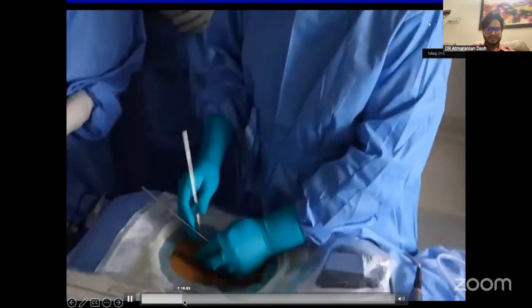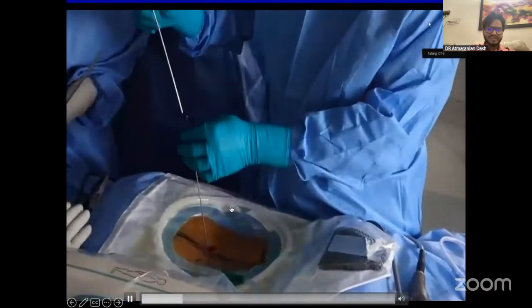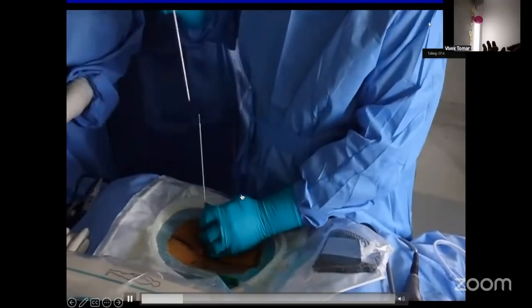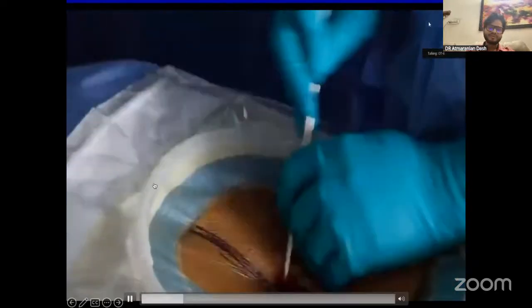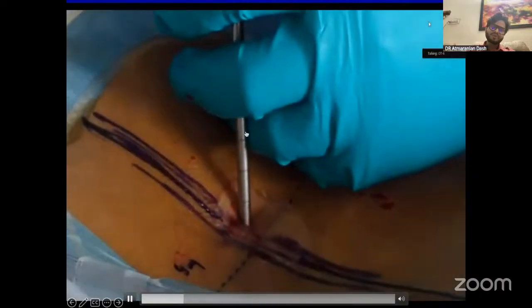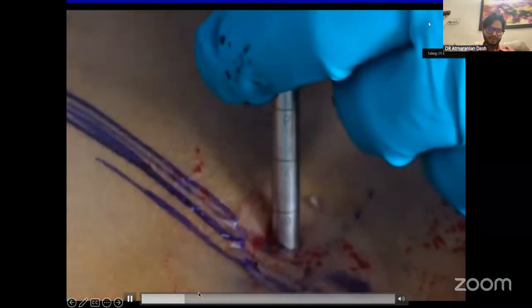Once the incision is done, we use these dilators. These are specially designed dilators by Gesto. The dilators are very small. This is irrespective of the normal dilators we use for UBE, which are bigger. So we try to minimize the incision by using a smaller diameter dilator. So the maximum thickness of this dilator is 6 mm. So you don't have an incision bigger than 6 mm in any biportal endoscopy.